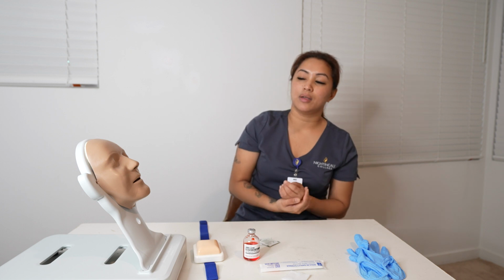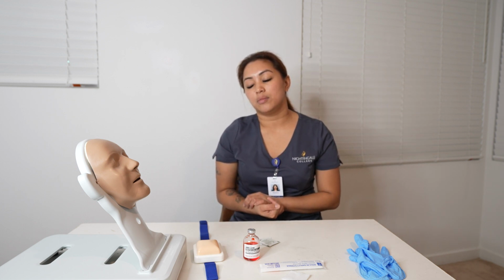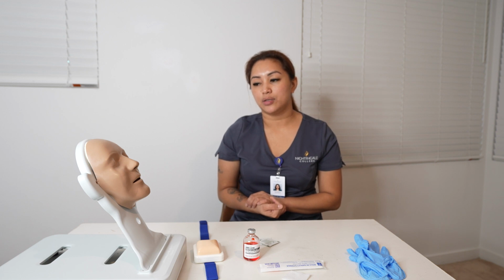Everything correlates. Alright, Miss Smith, I am here today to do a subcutaneous injection administration. And your provider ordered you heparin. Heparin is to prevent any blood clots in your system.